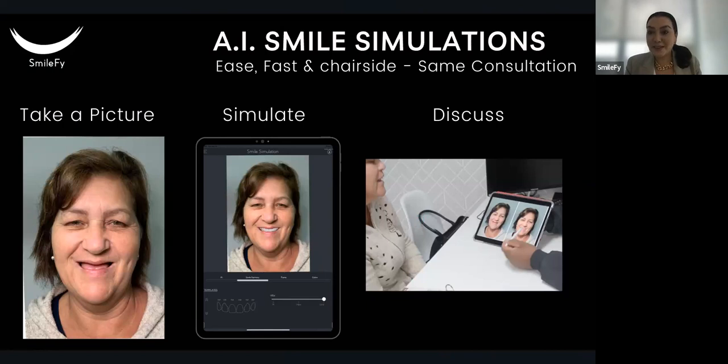Another thing that I like to use, as I am an implantologist from Brazil, depends on how you present to the patient. In the past, I remember I had a macro model with a big implant and crowns over it. When I started to explain to my patients that we're going to have two different steps, the first one is the surgical. I have your CBCT files, I'm going to place an implant, probably you will need a bone graft.